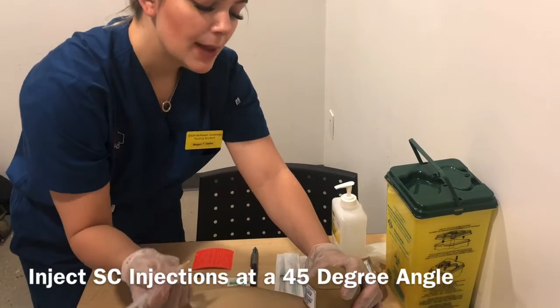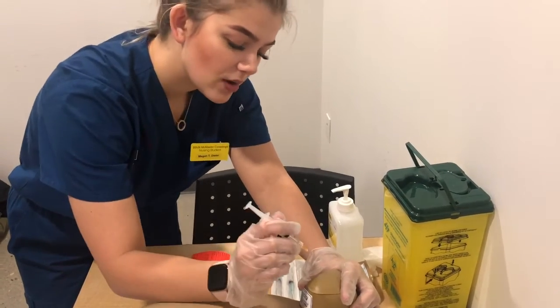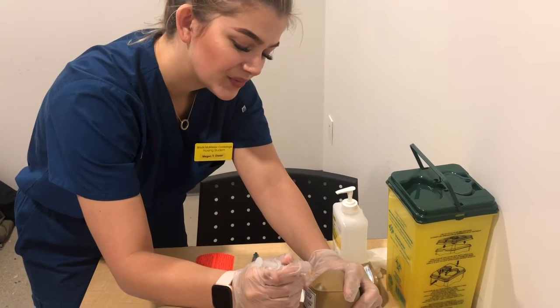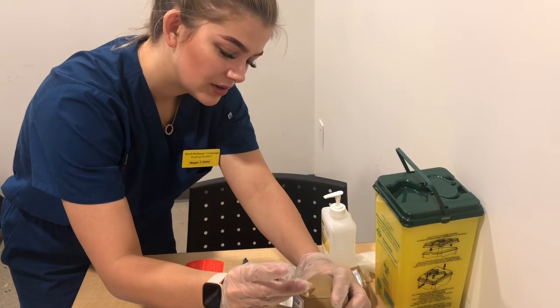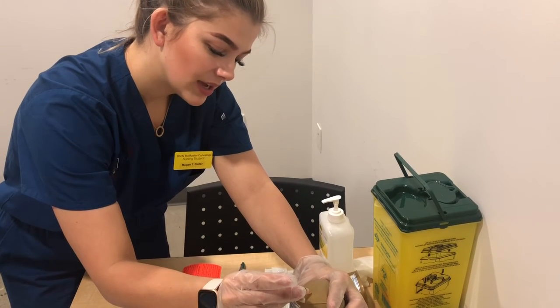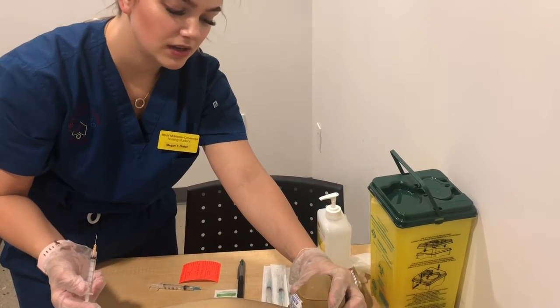Okay, so Mr. Mancini, I'm preparing to insert the needle. You're going to feel a slight pinch. So you can take a deep breath in 3, 2, 1. And I'm just going to administer the medication. Okay, and because we're administering heparin, you do want to make sure that when you withdraw the needle, you do keep the skin pinched.